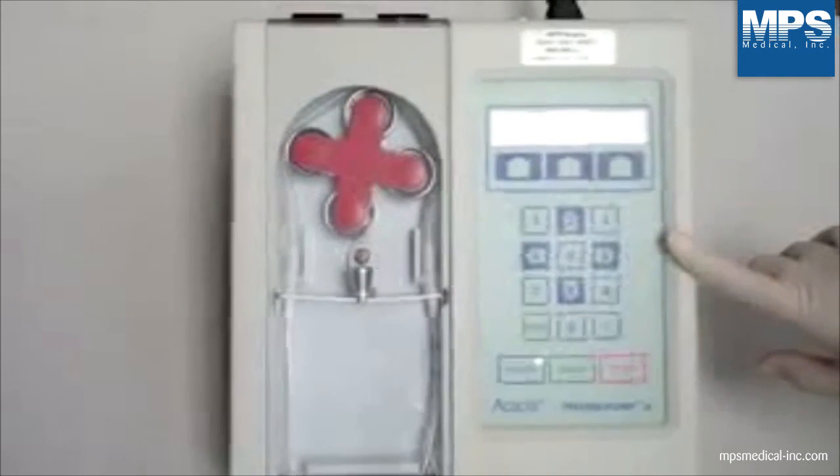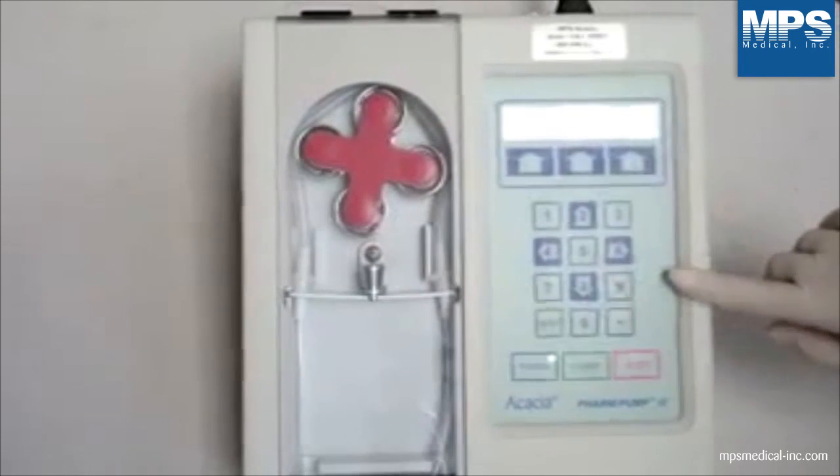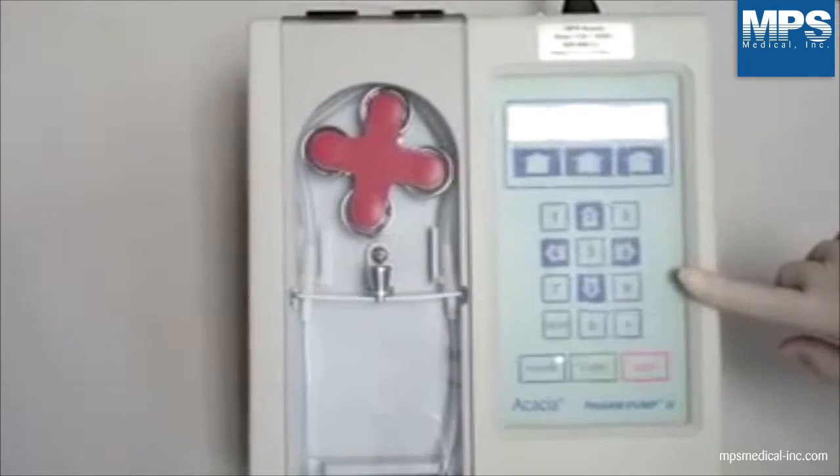Based on your fill volume, select the program by pressing 2 or 8 on the keypad. The filling pump is pre-programmed as follows.